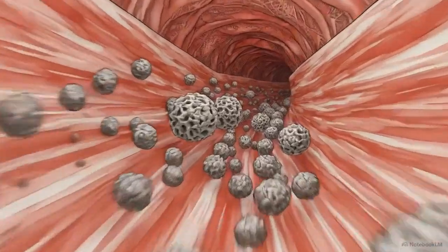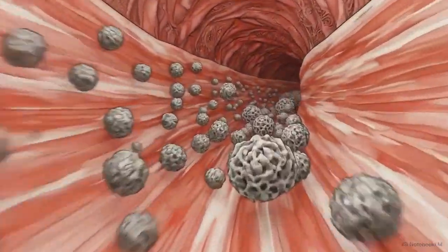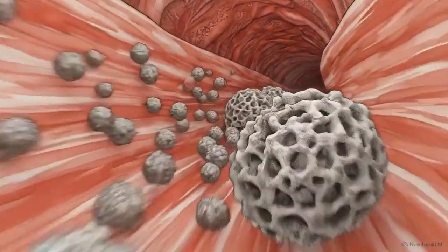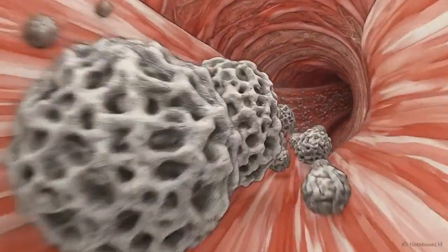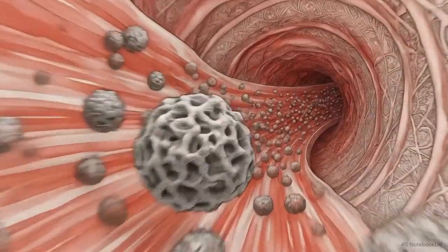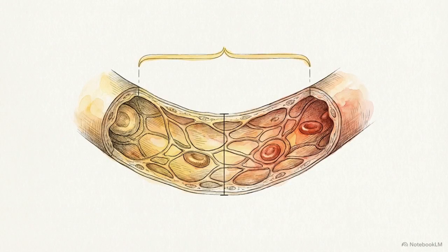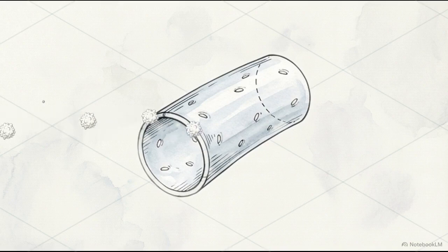We begin with mechanical trapping, used in the perfusion phase of a VQ scan. The tracer here is Tc-99m macroaggregated albumin, or MAA, and its entire job is to physically lodge itself inside the pulmonary capillary bed. The anatomical bottleneck we are targeting is the normal human pulmonary capillary, which has a diameter of approximately 10 micrometers. This diagram illustrates the size constraints.